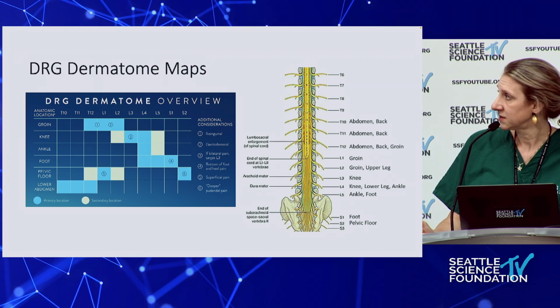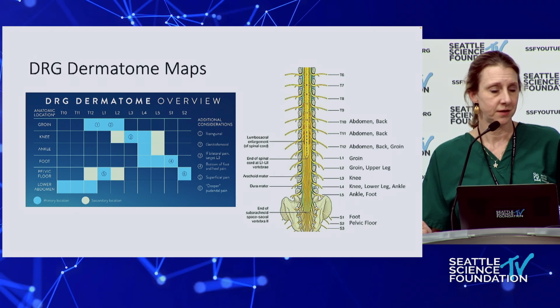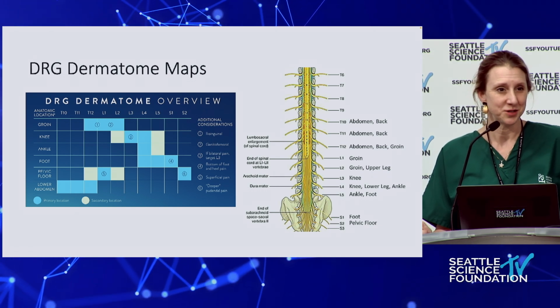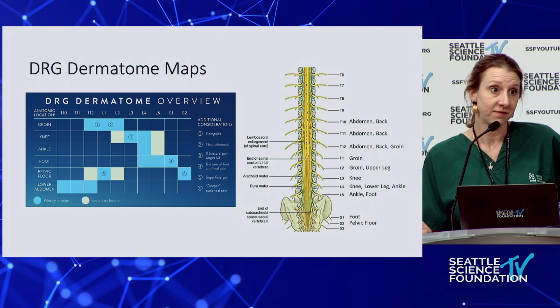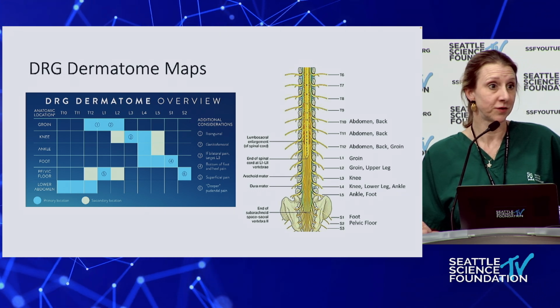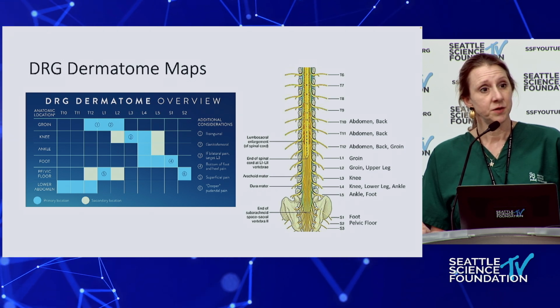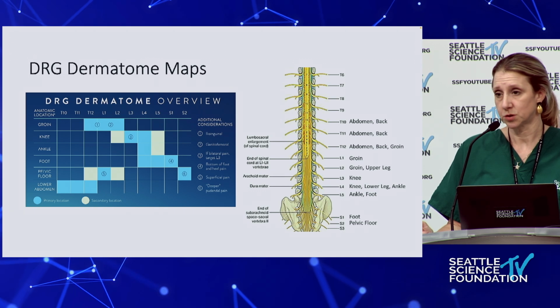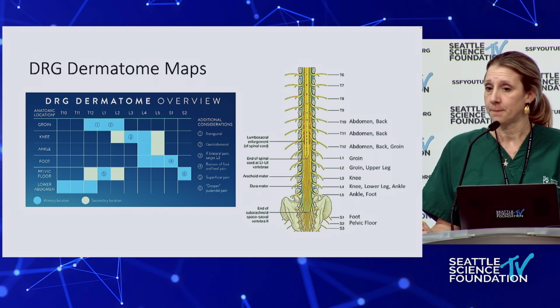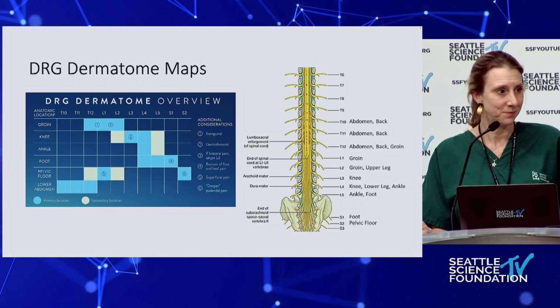Dermatomal overview, you can see here. If you are planning a procedure, it isn't hard to plan which levels to approach. I would say that doing L5 is a challenge. That wouldn't be your first level to enter in your first case. We also do some sacral approaches to dorsal root ganglion stimulation, which are surprisingly not as complicated as you may imagine.